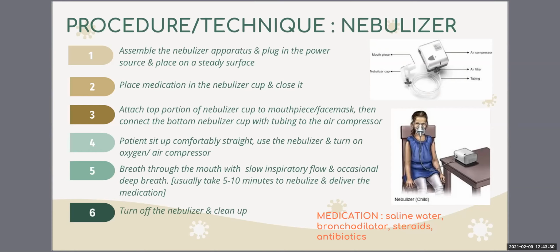Sometimes oxygen can also be used to drive the nebulizer if the oxygen level in the patient is low. And then ask the patient to breathe through the mouth with slow inspiratory flow and occasional deep breaths. This nebulization therapy usually takes around 5 to 10 minutes to deliver the medication. Lastly, turn off the nebulizer and clean up.